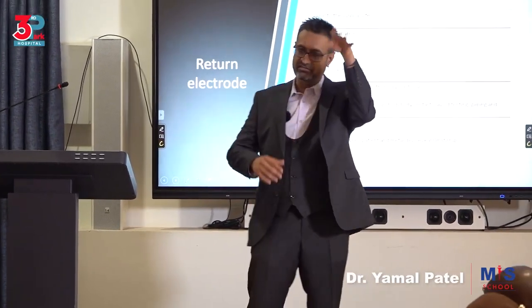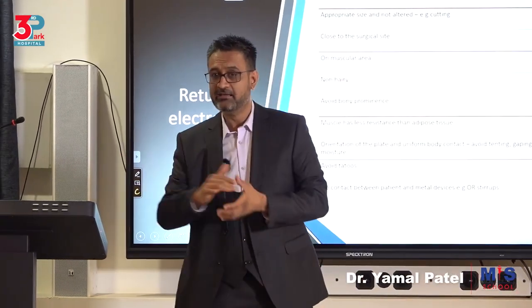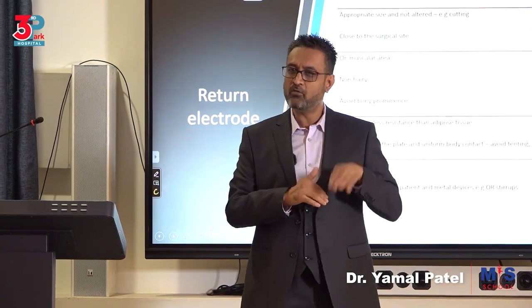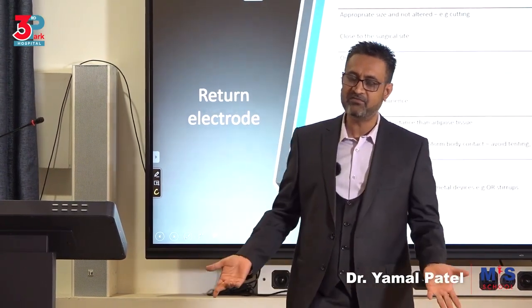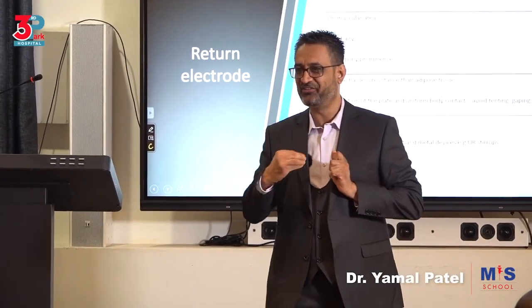Also, if this one that you put around, you must have seen the metal one. I don't know if you've seen the old metal ones. People used to put wet saline or wet fluid and then roll it and put it in, or gel. Why? They're trying to increase the contact. So people say, oh, they don't want it wet. Nothing happens if it's wet with saline, because it has electrolytes.